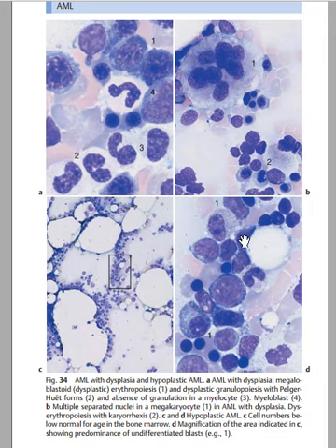Now the next one is diagram C and D. In this case, C is a hypoplastic acute myeloid leukemia, while these 2 cases are dysplastic. Is it clear? So for dysplastic, again, for diagram B, you can see megakaryocytes.